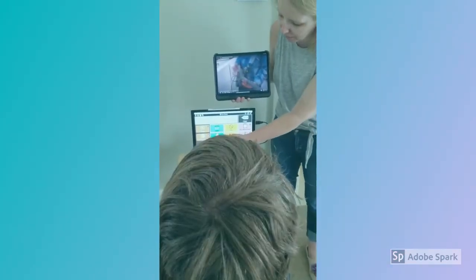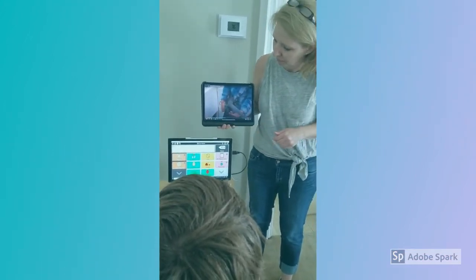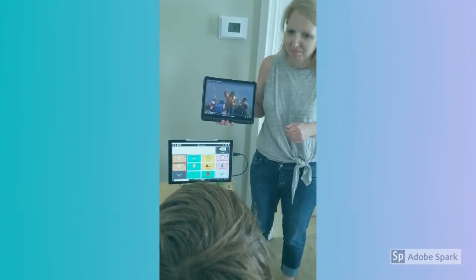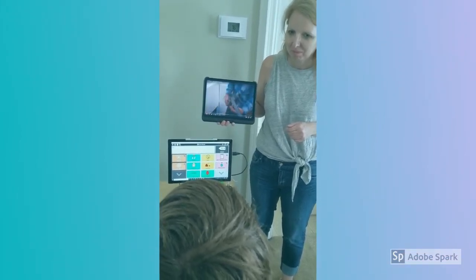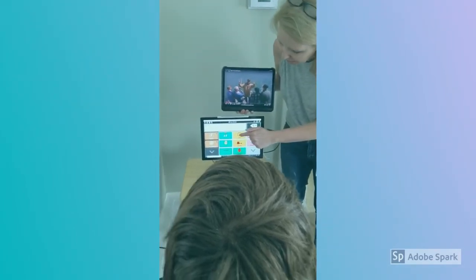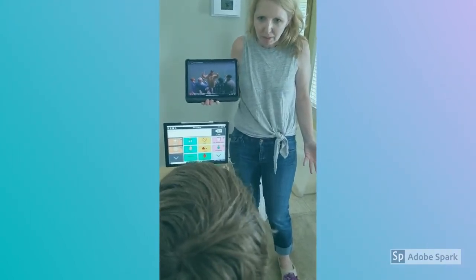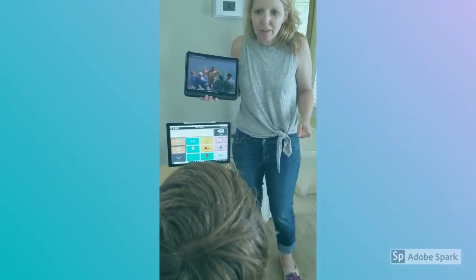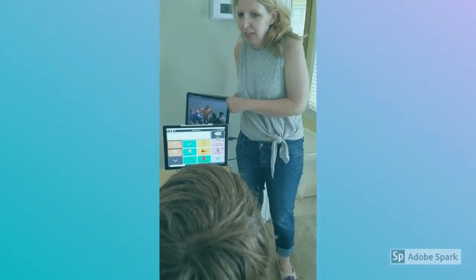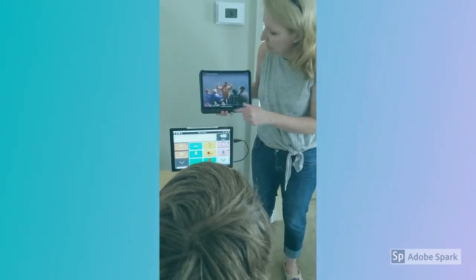All right, let's make the video. Go. Not. You said not. You do not want any more video? Okay, I'll put it away. More. Oh, more! You meant you wanted more. Okay, here we go.